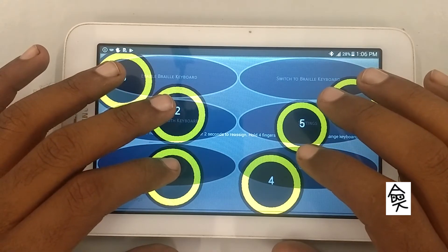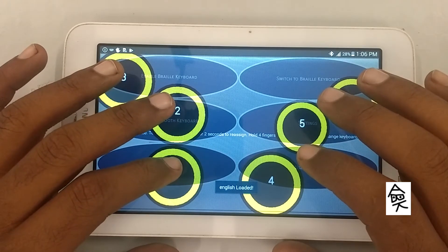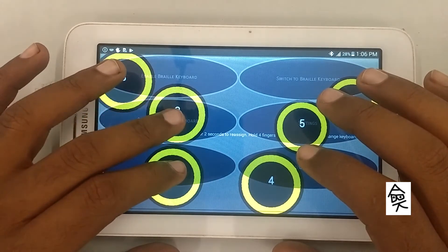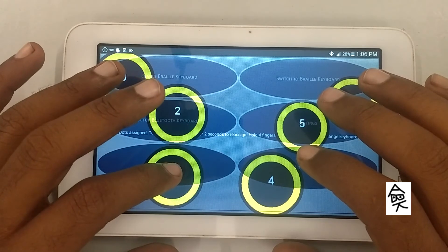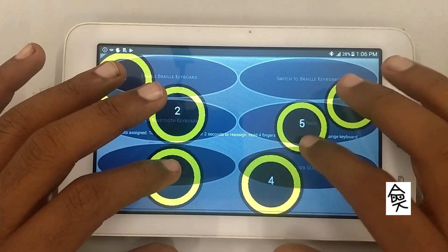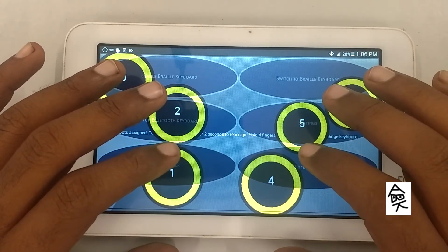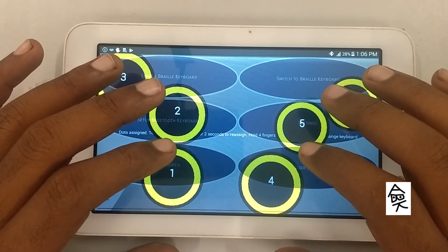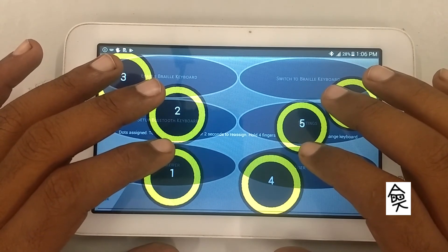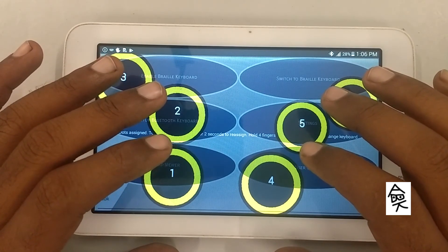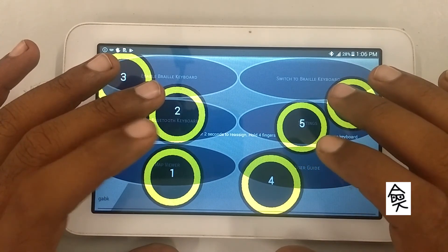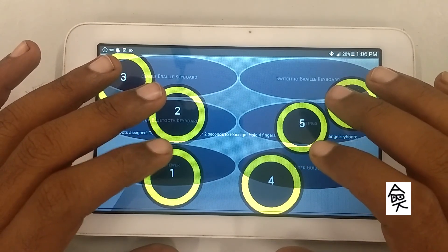Now I'm going to type. English loaded: A, B, K, G-A-B-K space. In manual calibration, you have to hold four fingers for more than two seconds to change the calibration again.